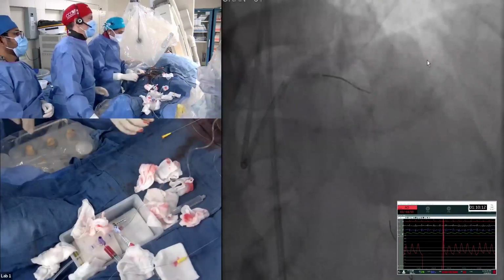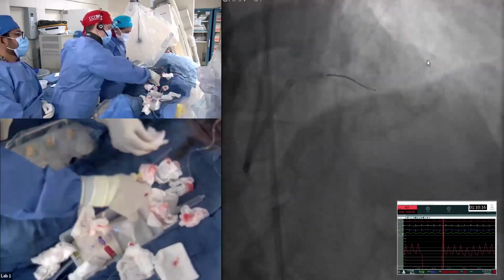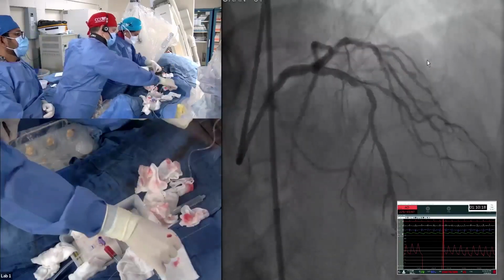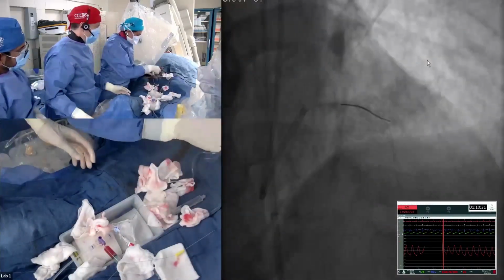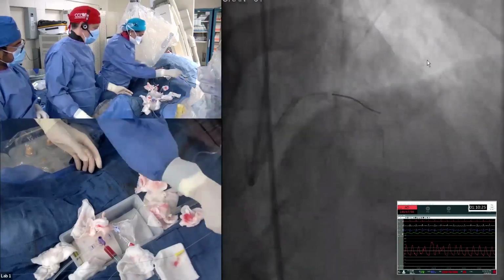Okay, looking everything is good there. Much nicer, yep. Looking good. I think at this point, you now just let me dilate and stent, no? Or do you want to still... I think yes, ballooning is okay. So now you can do ballooning now.